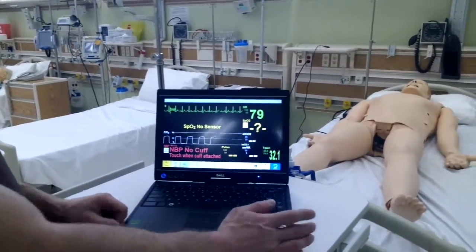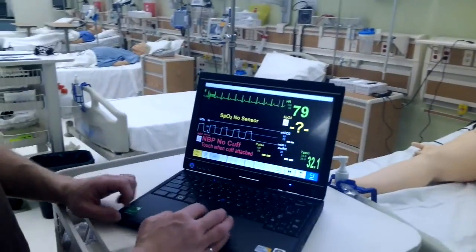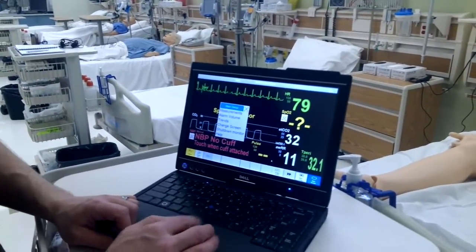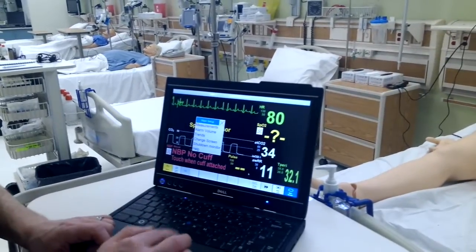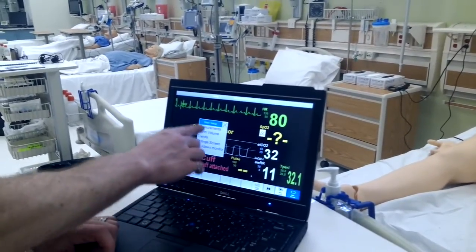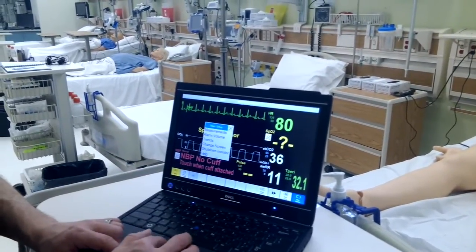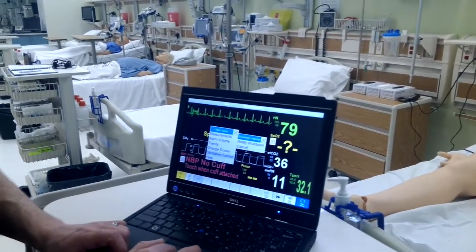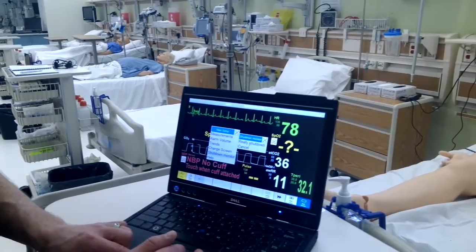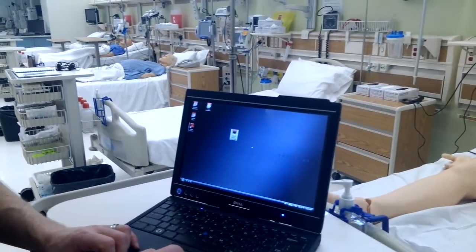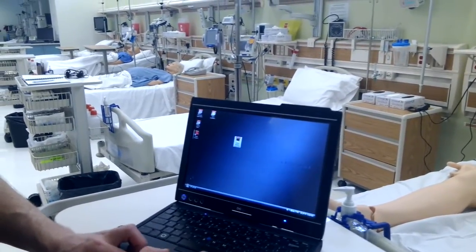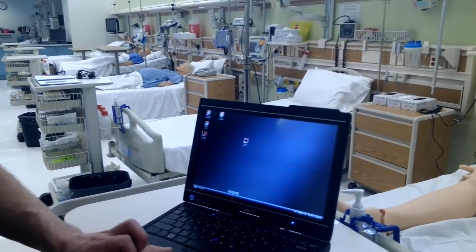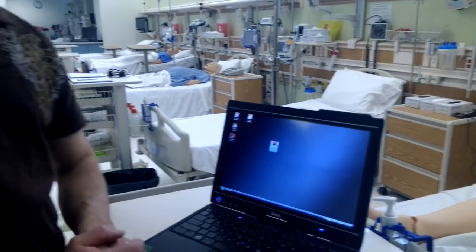If we want to exit this when we're done for the day, we go to Main Setup. Then we have different options and we can say Shut Down Monitor. It asks us again to confirm — really shut down — and it's gone. Then you can shut the laptop down as you would with any other laptop. And that is how we use the patient monitor.